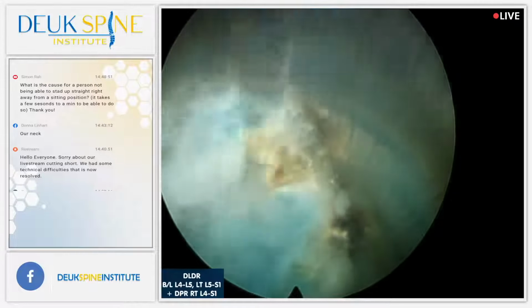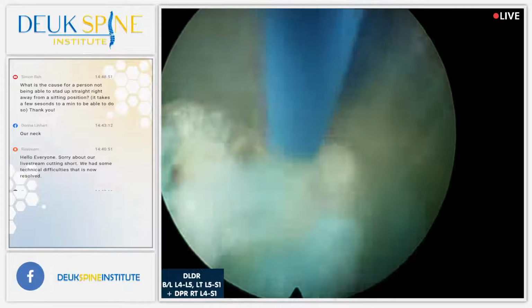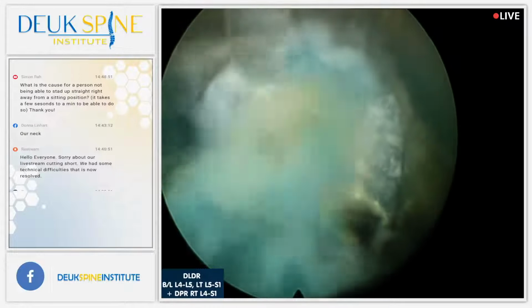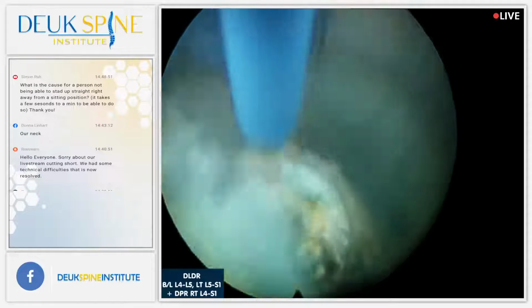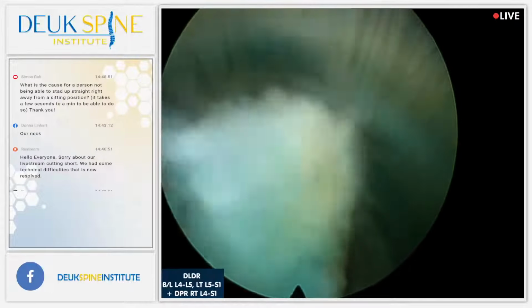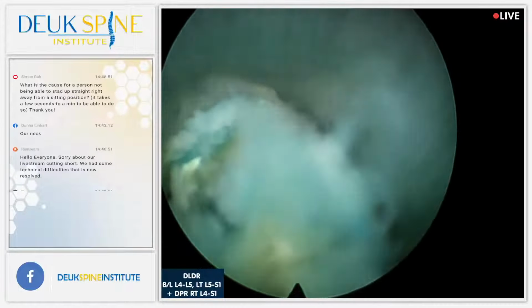There's some calcium right there. You see that? Basically the beginning of bone spurs. Turns golden color when you hit it with laser energy. It's always a sign that the herniation's been there for a long time, years. You never get calcium right away. It takes time.